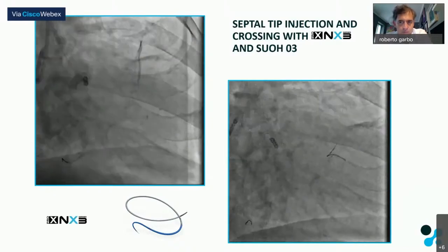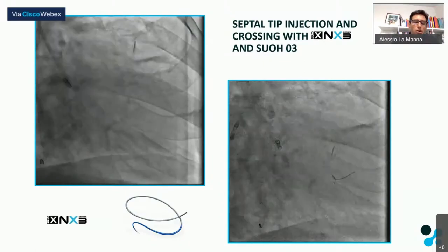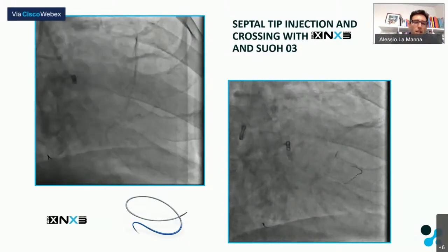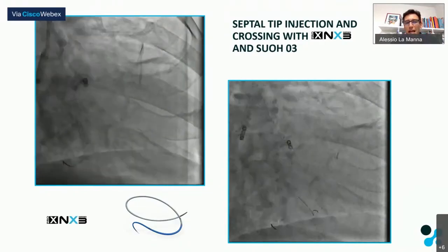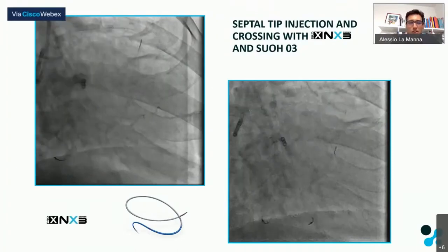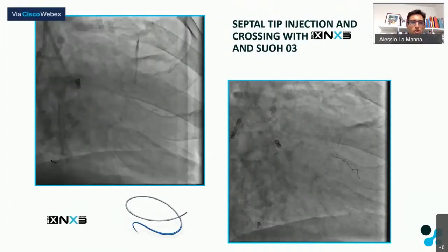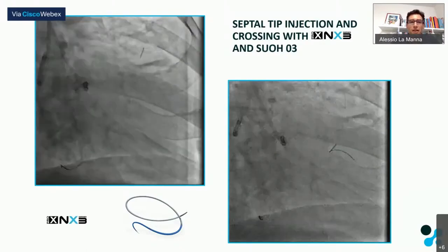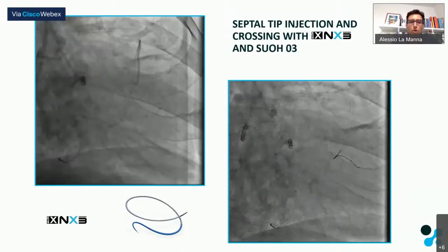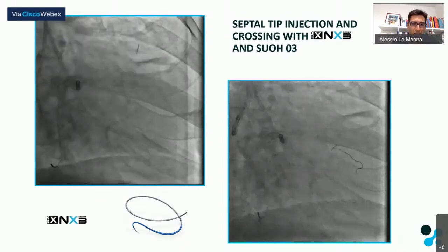Yes, just to comment regarding the previous issue. Of course, after you have already done a retrograde approach, you are normally tired. So you try to do an antegrade approach, IVUS guided. So this is the common way, I think, to approach such a situation. But many times, the only way you can get the final result is from a second retrograde approach. So that's a clear demonstration of what we are discussing.